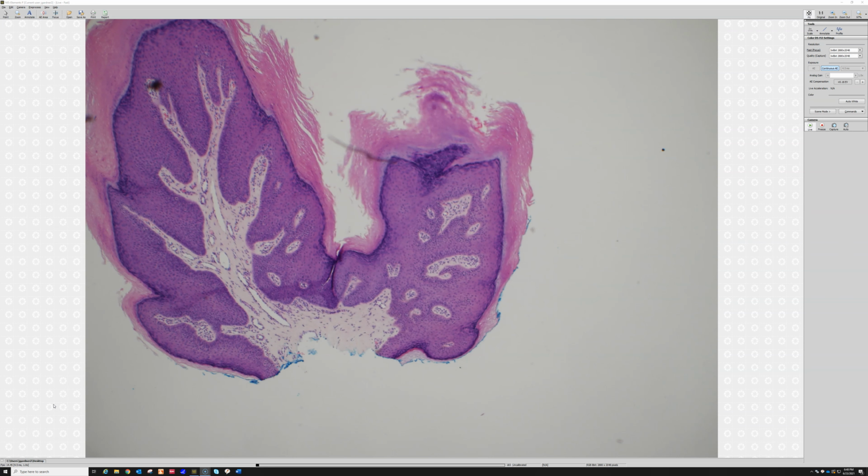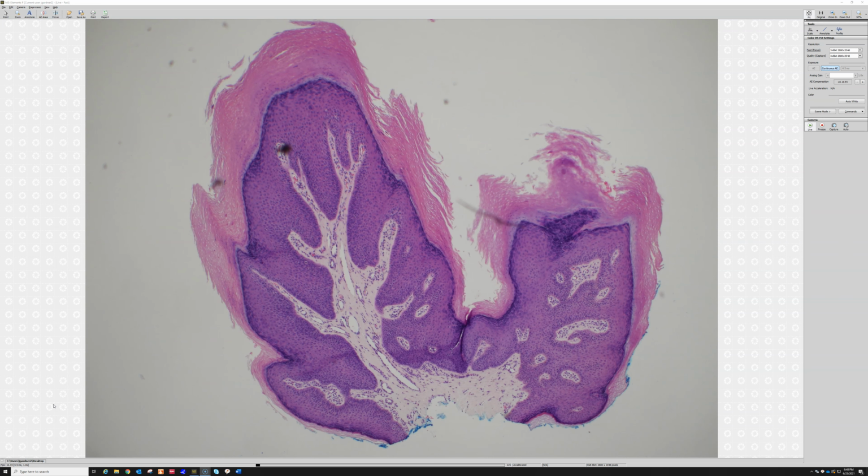So I still think this is a verruca, but it's much more subtle, and so I hope that this 45-minute mega episode of all the things you want to know about warts has been helpful to you, and hopefully you can see the progression from the really classic, perfect examples to some of the oddities, all the way down to these lowly little tiny ones like this, which are actually the bread and butter things that we encounter all the time. And if you don't know what the classic ones look like, with the perfect dramatic features, sometimes it's harder to recognize the more subtle ones.